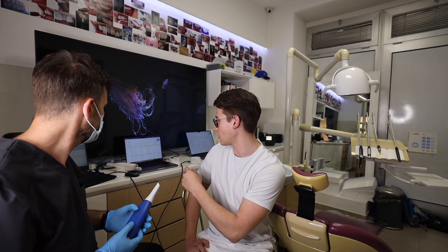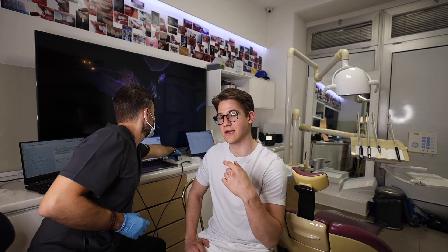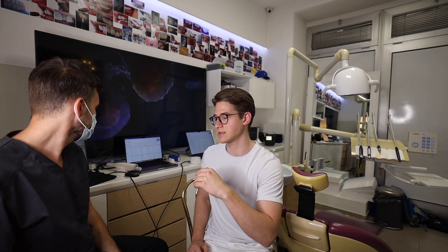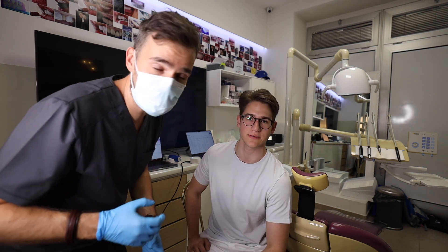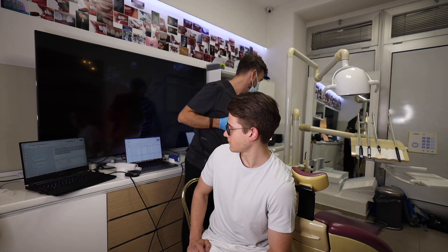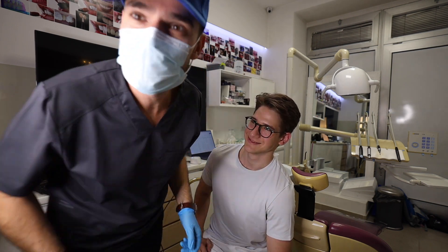All the tests we did were scanned using the zigzag strategy, so we expect the results to be really similar across scanners. But now we're going to deliberately scan using the standard way — which we consider the less optimal approach — scanning the occlusal side first, then the palatal and lingual. For this scanning, I'm going to put on my Medit cap that I forgot to put on earlier. So we're now ready for scanning.